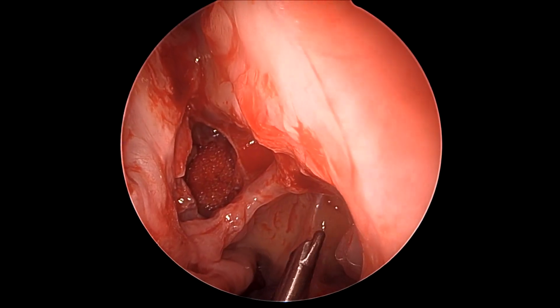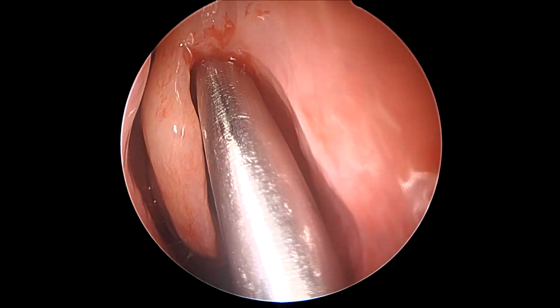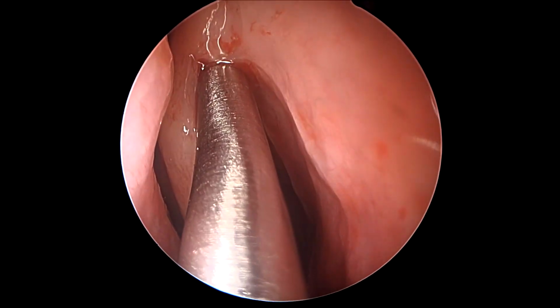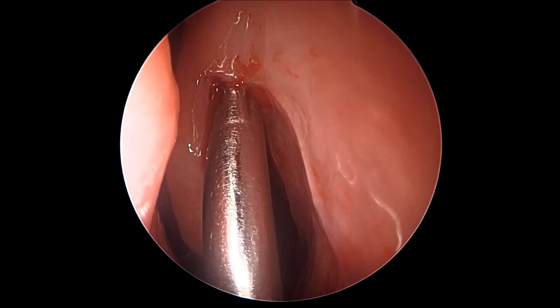Here once again we are tracking our most important landmarks which we use throughout the surgery, such as the superior wall of the maxillary sinus, or the horizontal antrostomy ridge which points towards the sphenoid, and the transitional antrostomy ridge which points towards the posterior ethmoids.